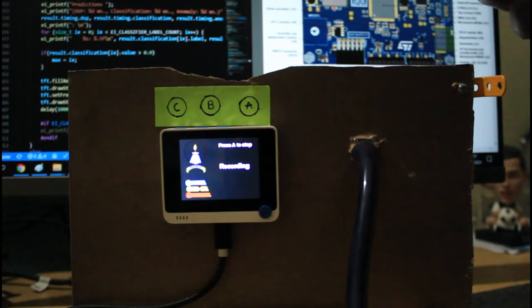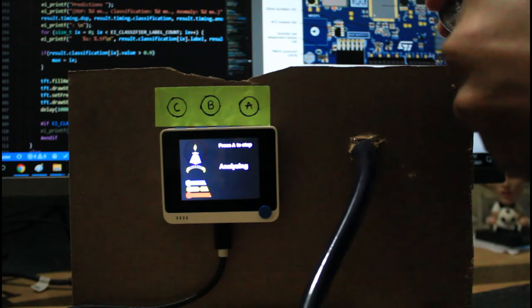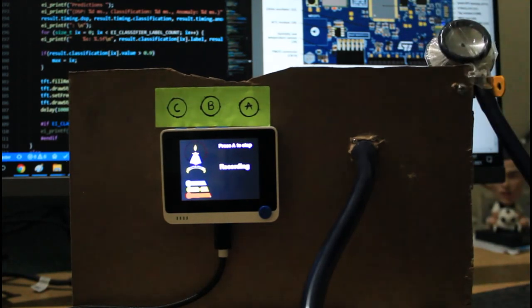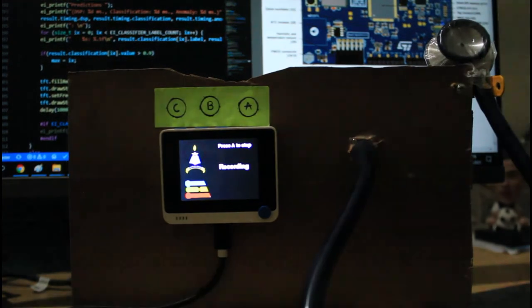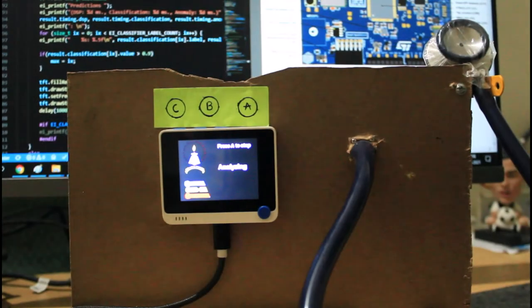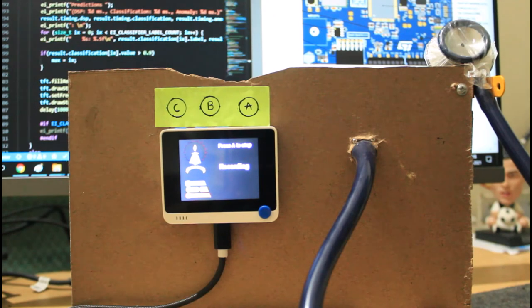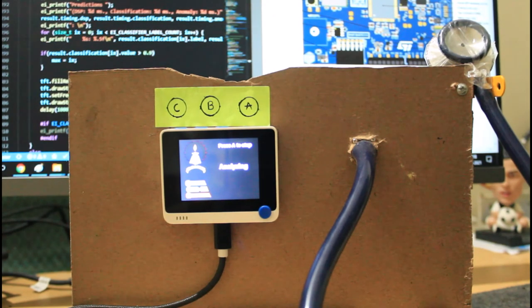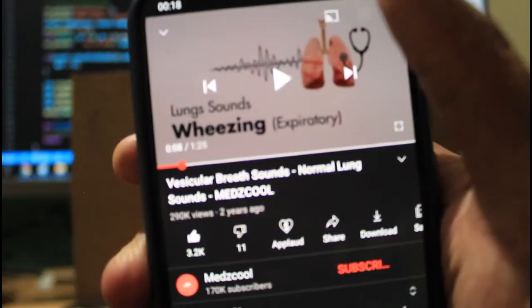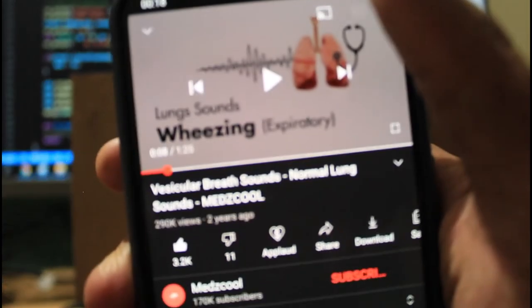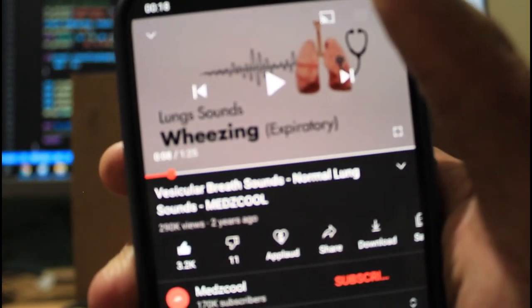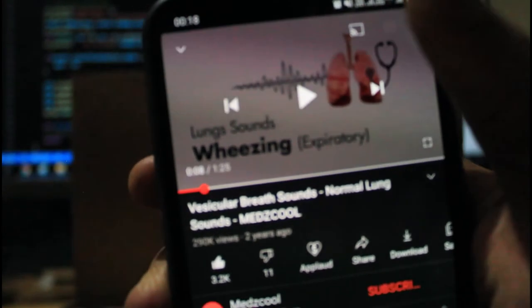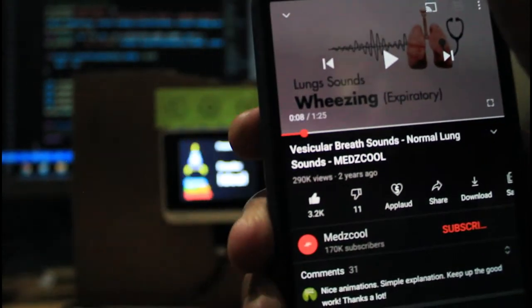Now, if I place the stethoscope and use some of the playlists from YouTube, such as wheezing, it should give us a wheezing sound.